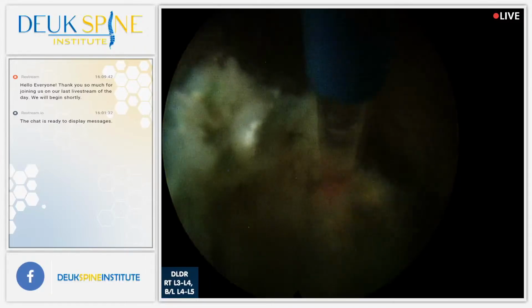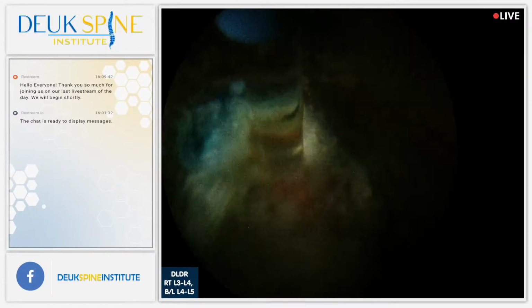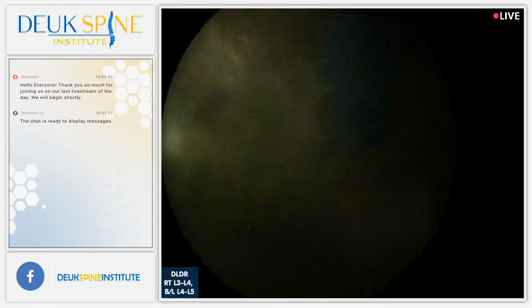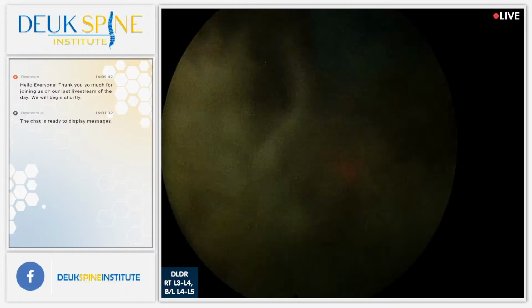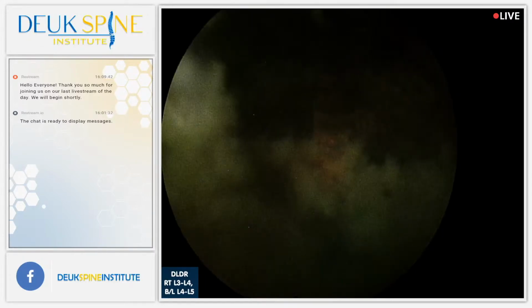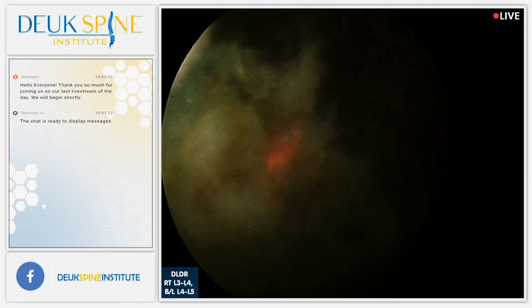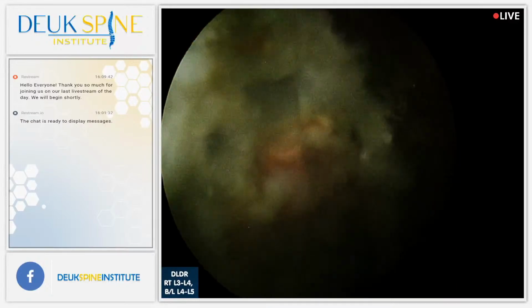If you have to use metal instruments, a bit old-fashioned. We still need them to cut the skin and still need them to get into the disc, but once you're here, we want to use a more advanced instrument, the laser. Now, these lasers, of course, are all FDA approved. The FDA has approved the laser and the fiber.